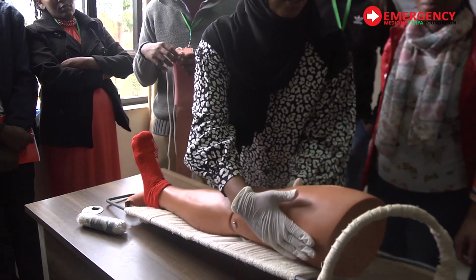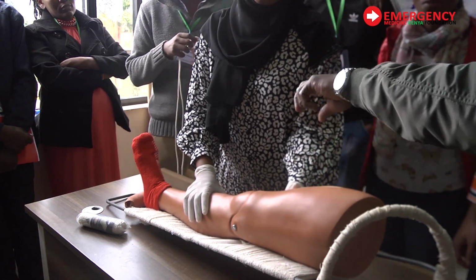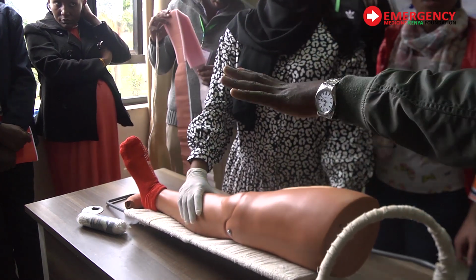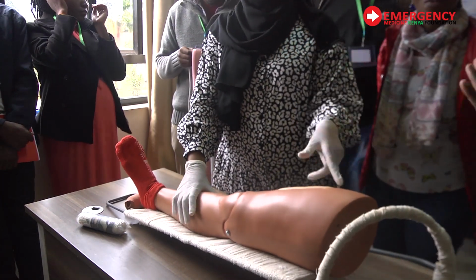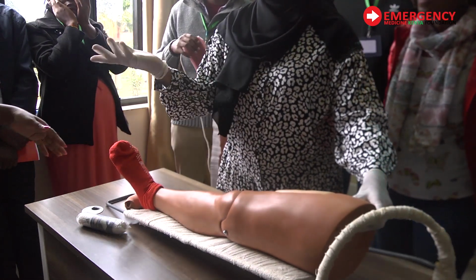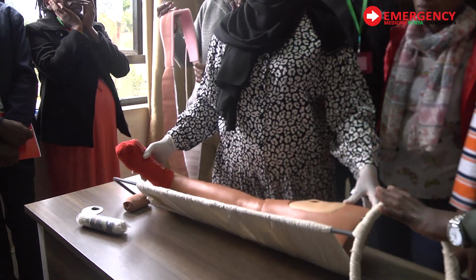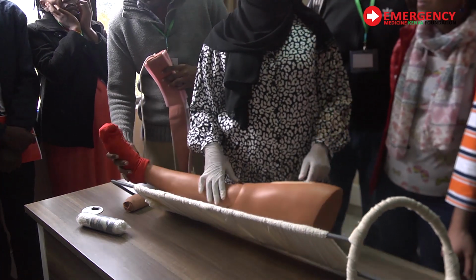And what do you immobilize with here? It's only the crepe? Yes. So you use that for transportation? Yeah. Not something the patient sits with in the ward? No, it's only splinting as you transfer. Okay, that's fine. I thought the patient stays in the ward as you wait for the surgeon. Even for an accident, you can mobilize. You just immobilize like this and then you use your crepe. That's something good I've learned today. I thought most of the time we do this because of the low resource setting.